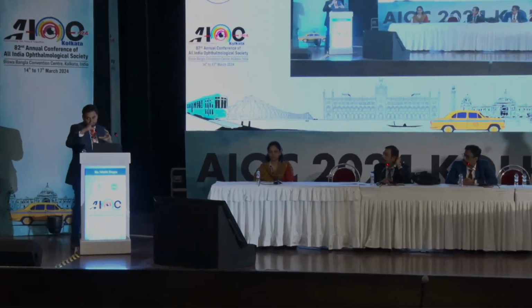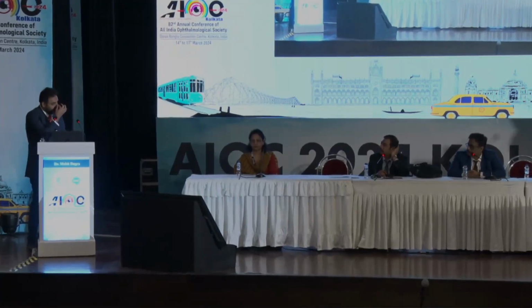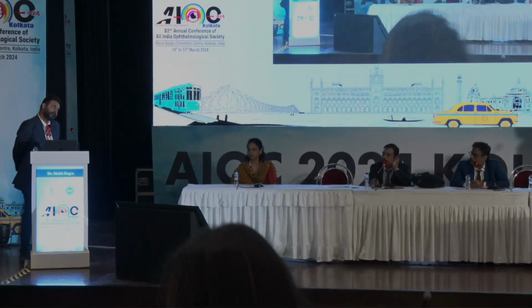Basically, they should know what the drawbacks of wide field photography are. The inferior part of the fundus is not readily visible. You cannot detect a flat HST. Number three, sometimes dialysis can be missed, because in anterior retina you are doing the indentation ophthalmoscopy; you cannot get the dialysis. Also with eyelashes, sir. And people with deep set eyes. Yes. You might be seeing a lot of things otherwise, but the image might not come out as great because you can have a nose artifact. You can have lots of eyelashes which will actually impede a lot of the view. Even within a CRA patch, whether a retinal atrophic hole is there or not, whether we should do laser or not, that is also important. Absolutely.